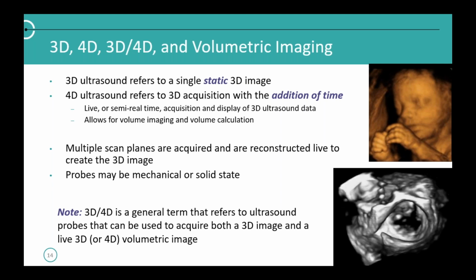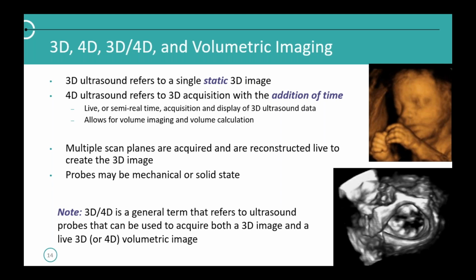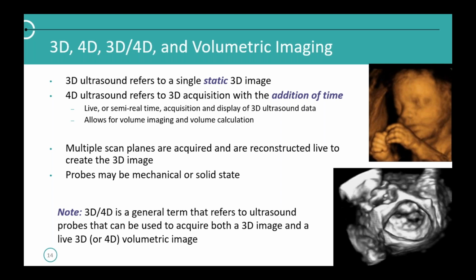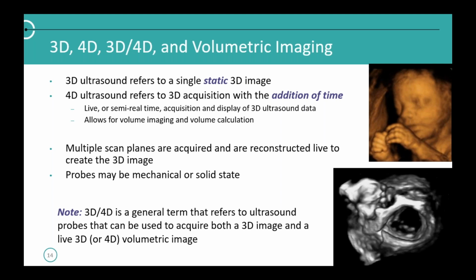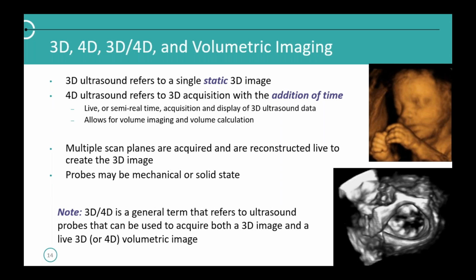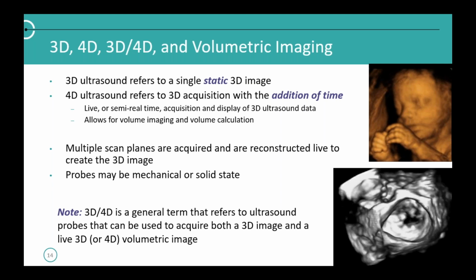Now, if I say 4D ultrasound, we don't have an image. We have sort of like a movie file, so we can watch the baby floating around in the womb. This is also a 4D ultrasound image. Sometimes it's called live 3D. Different manufacturers use different terminology. But here, I'm actually looking down inside a heart chamber, and I'm looking at the valves opening and closing. With the move of a trackball, I can rotate this up and around in free space in 3 dimensions and look at that and actually measure the volume in the heart chambers.